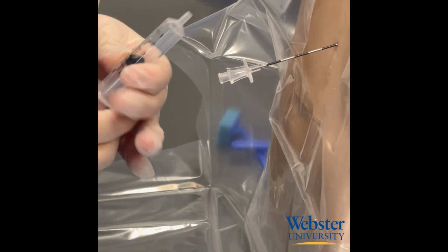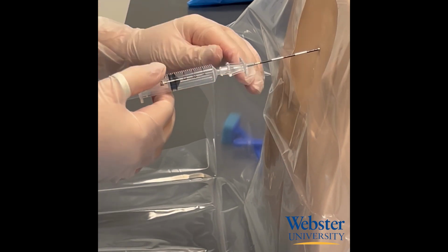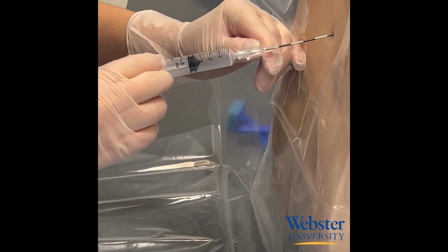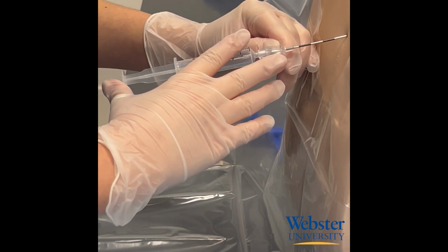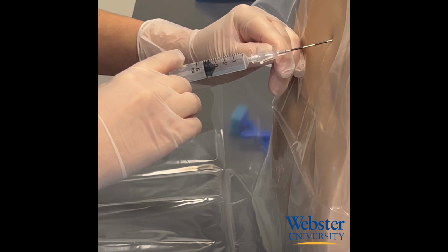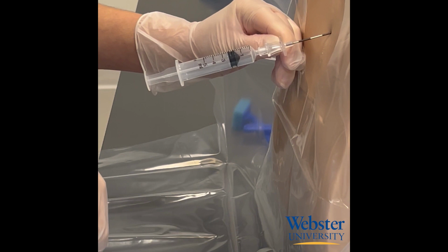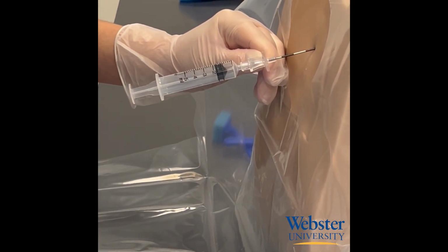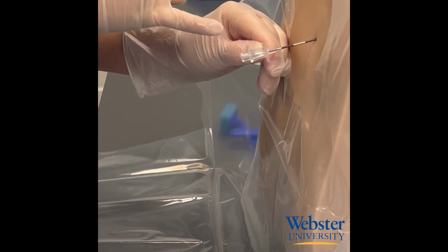There are a couple techniques you can use to find the epidural space. First, you can insert the needle a couple millimeters at a time and test the syringe to see if there's resistance. This is my preferred method, or you can try to hold continuous pressure on the syringe while slowly inserting the needle until you achieve loss of resistance. Once that resistance is gone, the end of the epidural needle is in the epidural space.